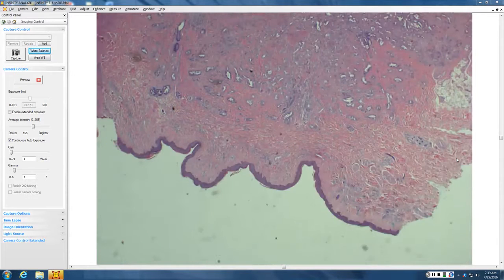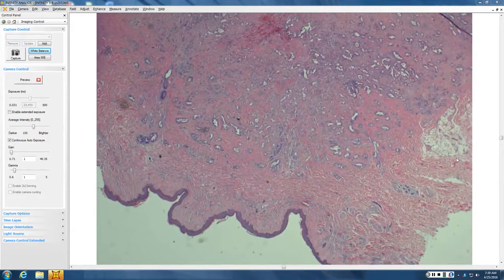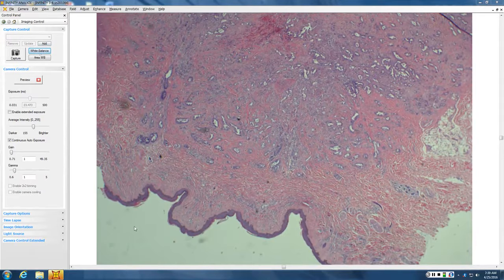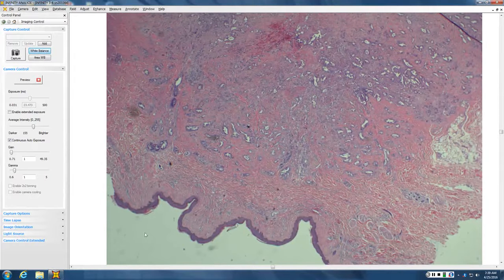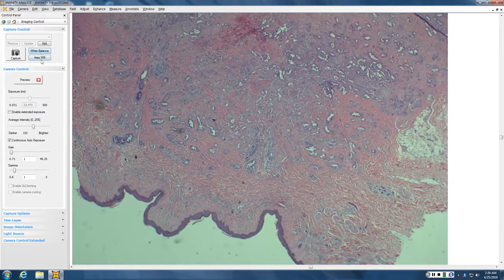So here's our first one. Did you white balance and everything? Yeah, it's different software. It's on auto exposure, and then do we have to choose an area for the white balance? If you have white balance, you just do area white balance, and then you draw. You're not having trouble. I see. Okay. Got it. You're sarcastic. There we go. Look at that.